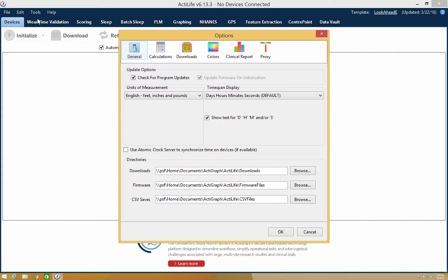Within options, you have the ability to access your general settings and you can change things such as whether you'd like to be prompted for software updates, change your unit of measurement, or change your time span display.